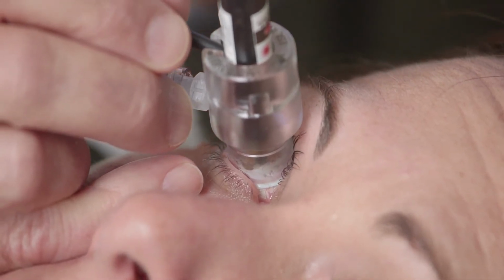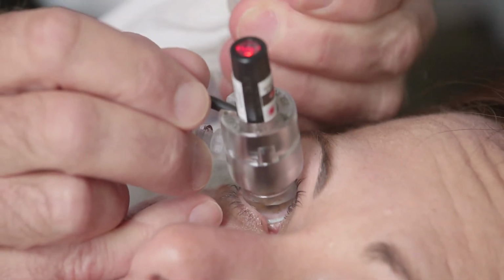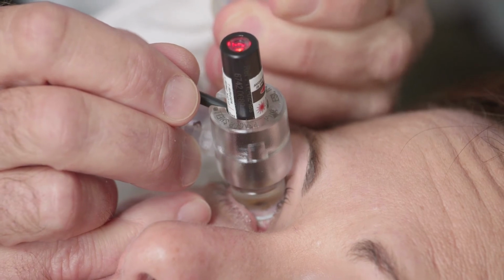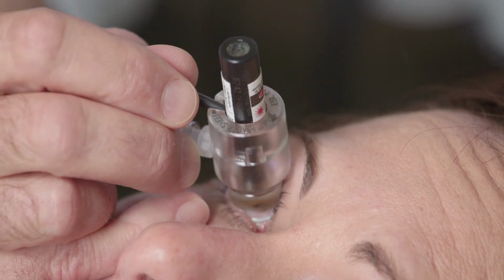For other shells, the coupling medium must be poured into the top of the shell with one hand, while the other hand stabilizes the shell on the eye. Each examiner should find the method that works best for them.